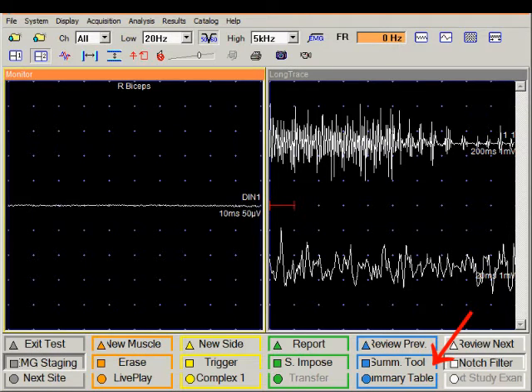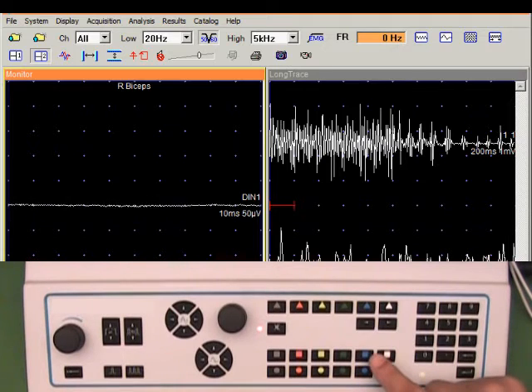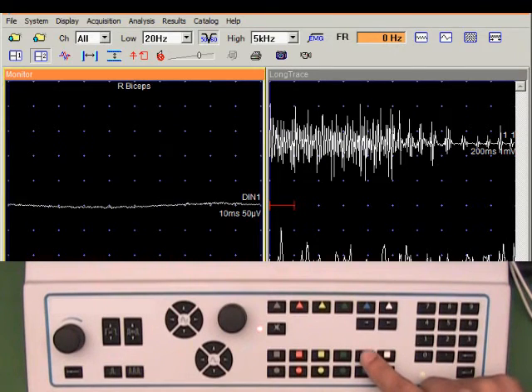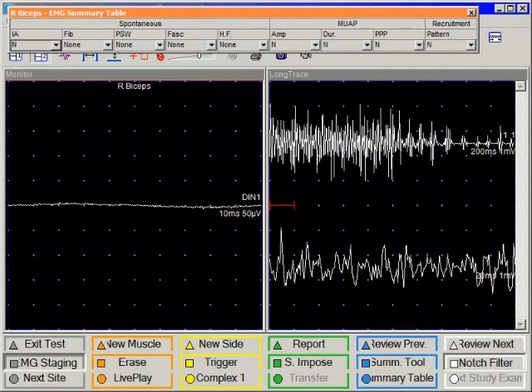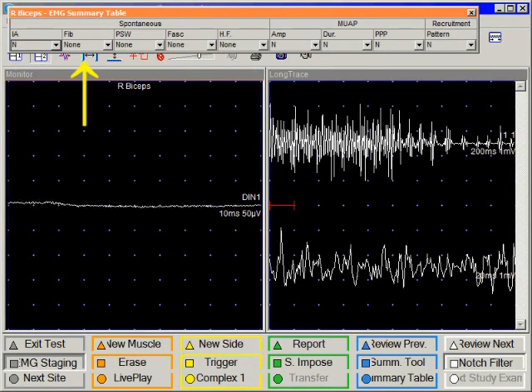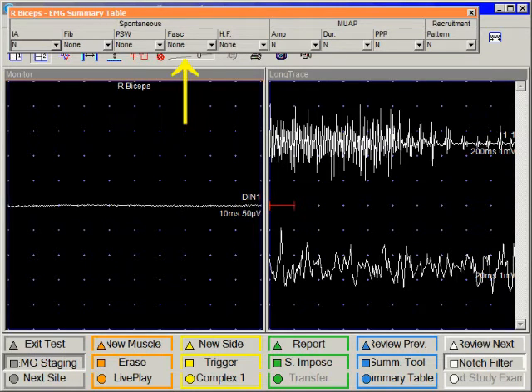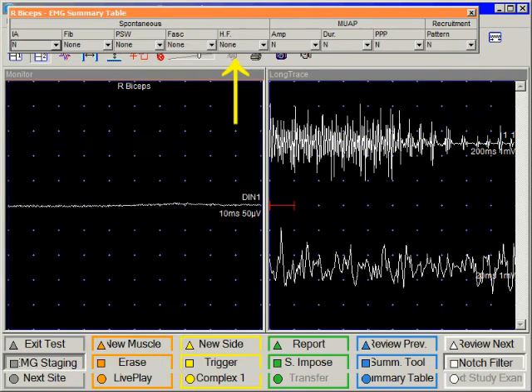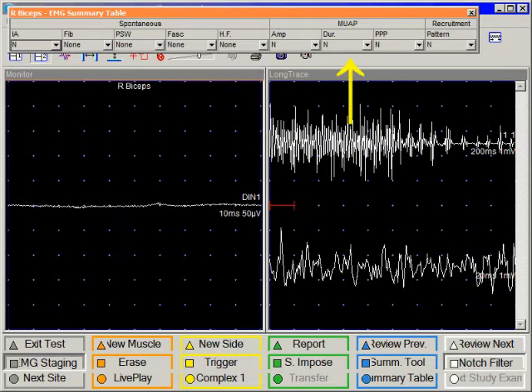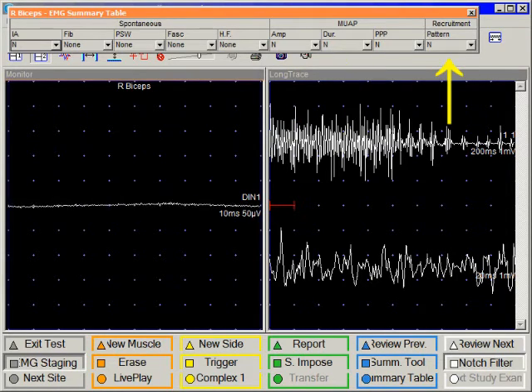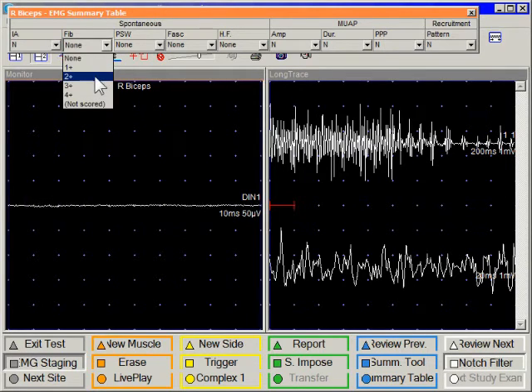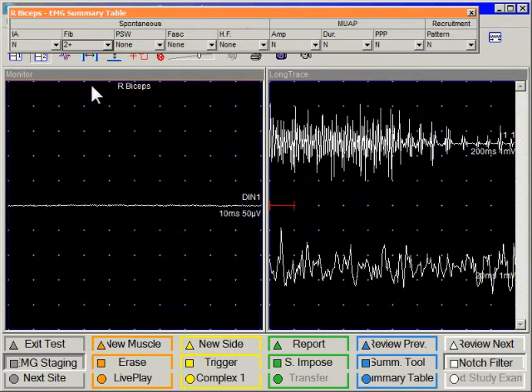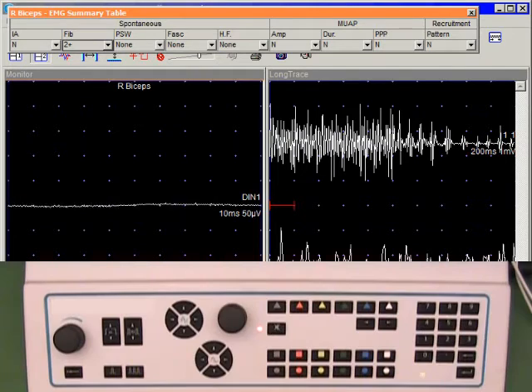We can invoke the summary toolbar using the blue square key. By default all EMG findings are reported as normal. Therefore if the muscle is normal we really don't need to do anything to this toolbar. If we find abnormalities they can be scored quite easily by using the mouse. For example the fibrillations were 2 plus. One can also use the arrow keys on the console.